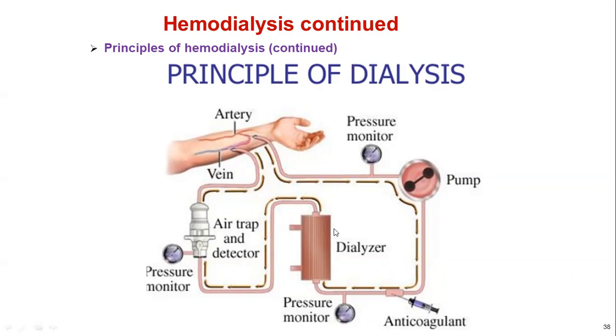So in the dialyzing machine, one of the small units is called the dialyzer, right? Here you can see the line from the artery to the apparatus. The dialyzer is connected to the body through the fistula or artery. And this is the pumping machine as well. And this one is called tubing or the selectively permeable membrane, which is called the dialyzer, right?